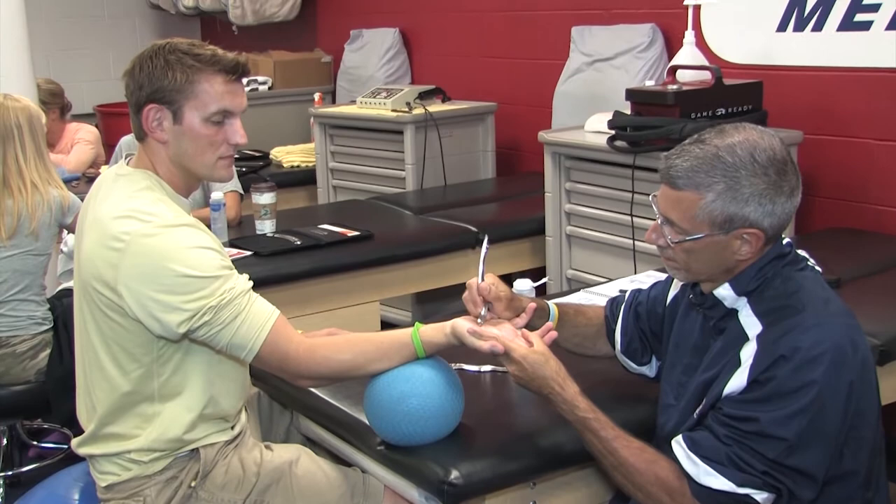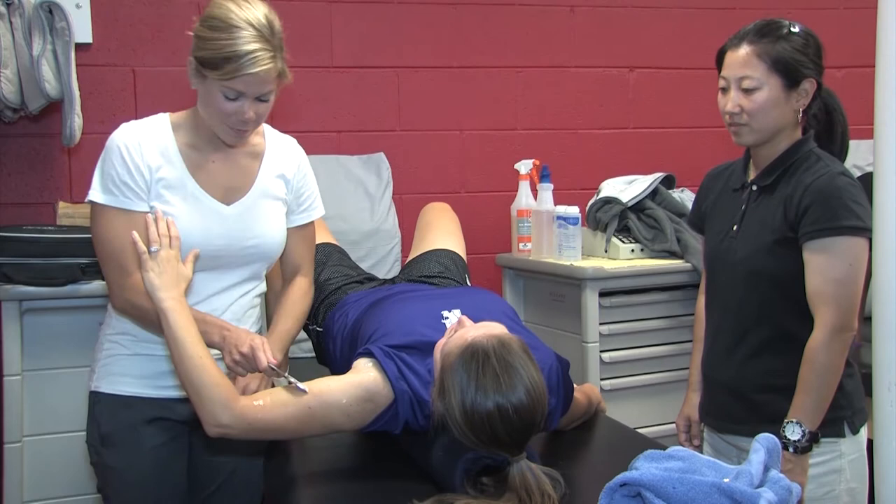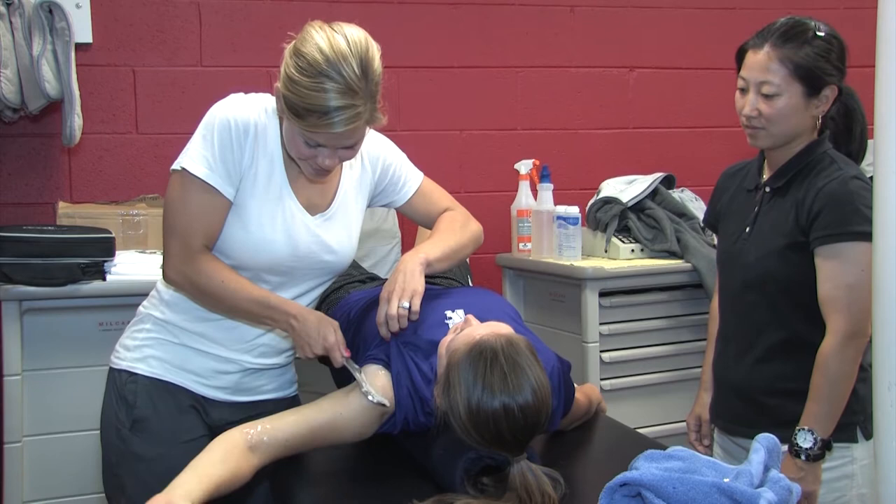I'm working on the thenar eminence, and he can contract, curl a little bit, extend a little bit, go back and forth. You're already doing a combination of scooping and sweeping — active range of motion with application of the instruments.